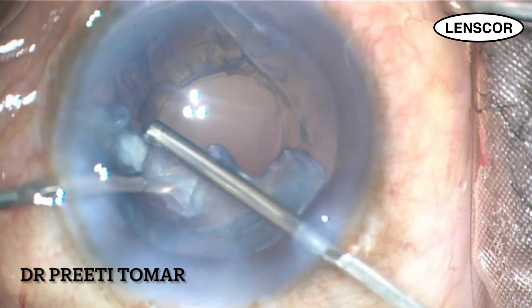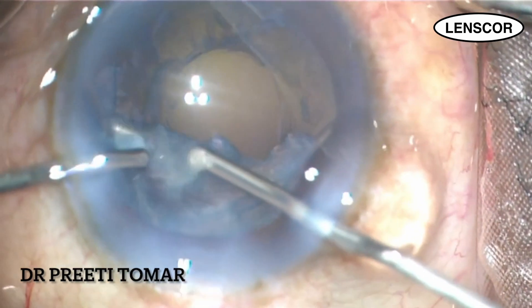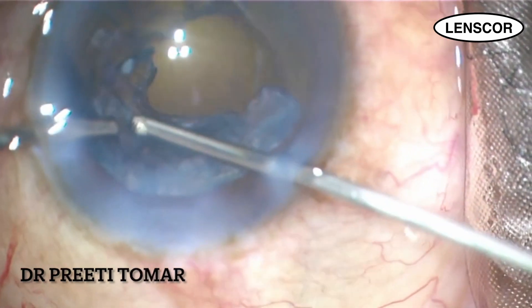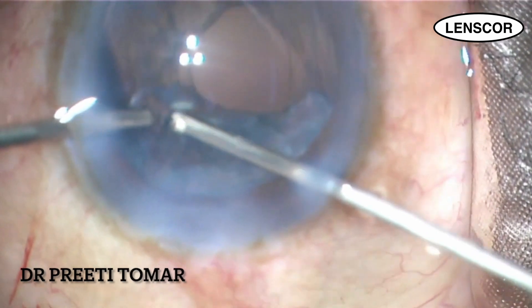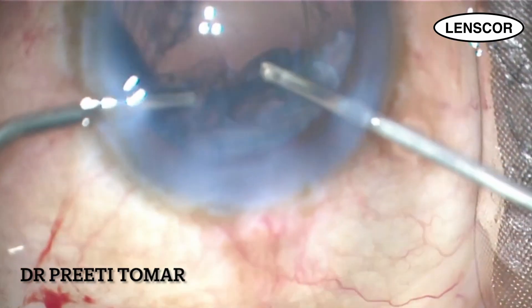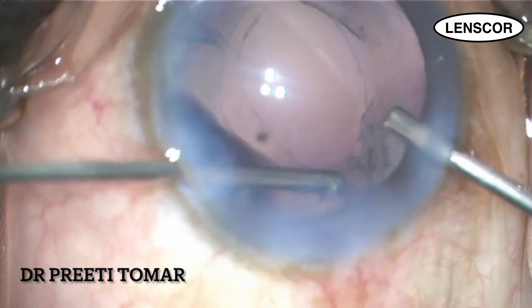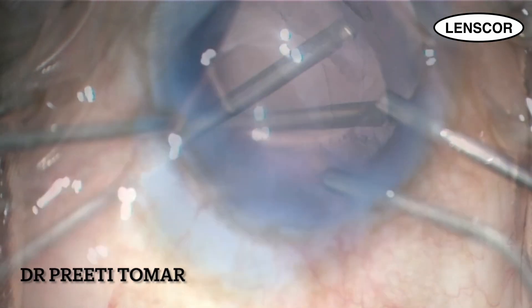I ask my nursing assistant for the vitrectomy cutter and go ahead with anterior vitrectomy. I first use cut-I/A mode with a cut rate of 2000 per minute to cut the vitreous in the AC and at the area of the capsular tear. After successfully completing the vitrectomy, I switch to I/A cut mode to aspirate the remaining sub-incisional cortical sheet.